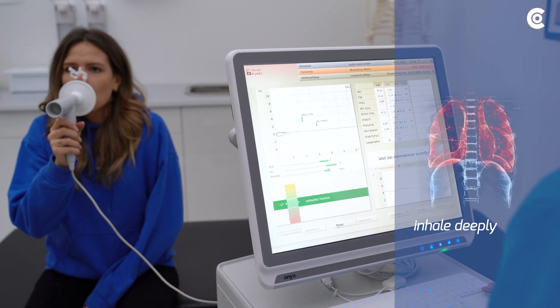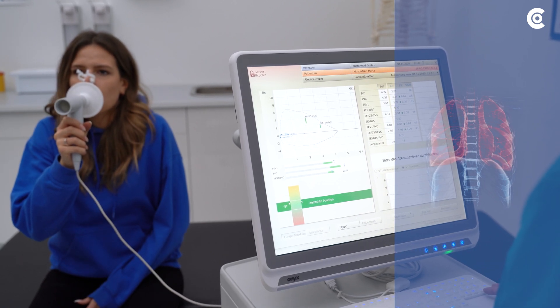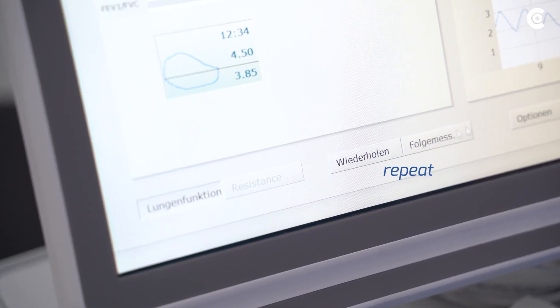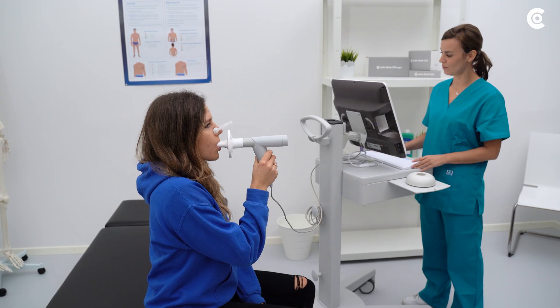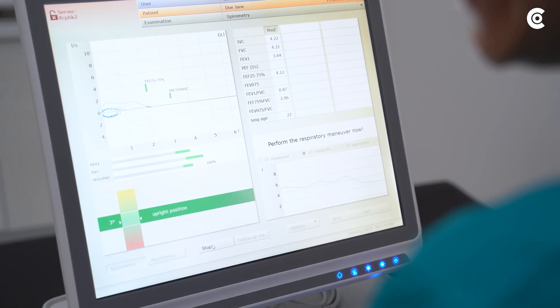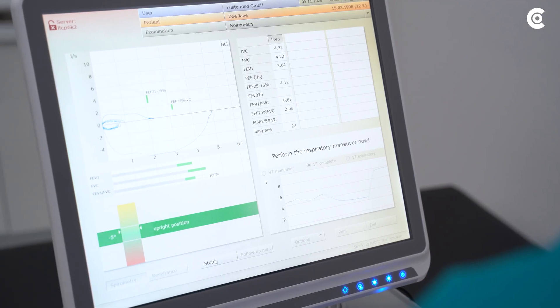For the breathing maneuver, the patient must inhale as deeply as possible and then exhale in a short burst. Repeat this process at least three times to obtain a reproducible result. Observe the patient and the breathing curve and watch for possible mistakes during the execution of the breathing maneuver. Support the patient with gestures and clear instructions.